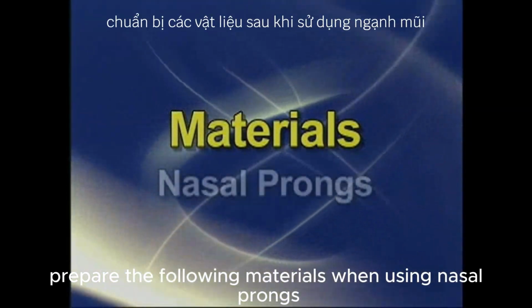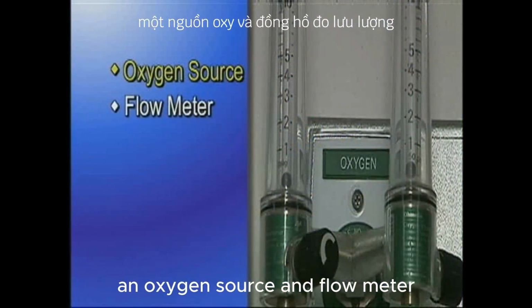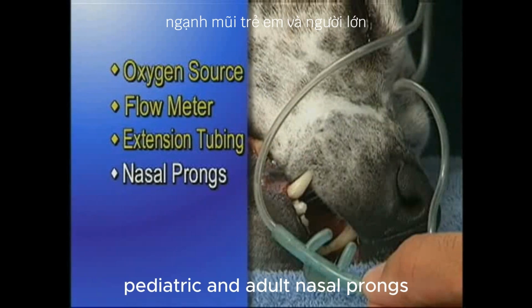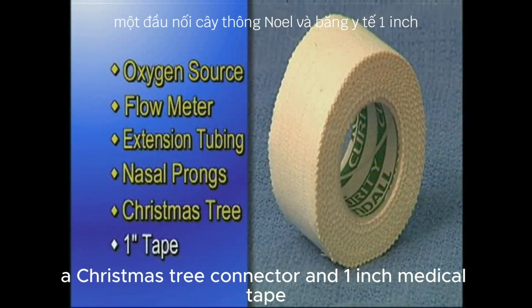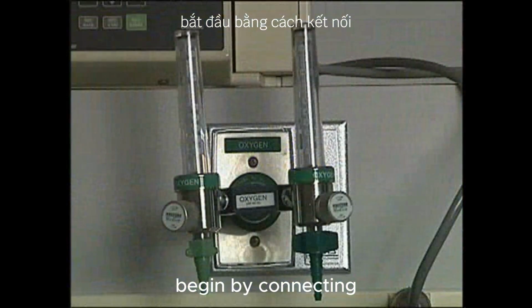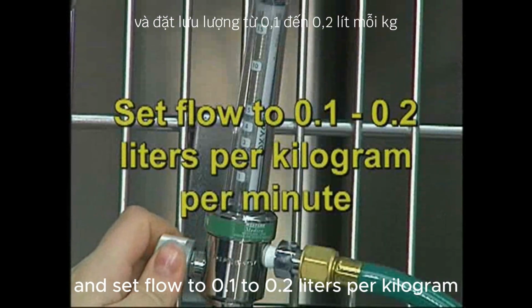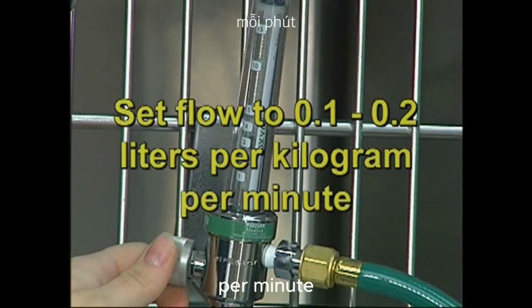Prepare the following materials when using nasal prongs: an oxygen source and flow meter, oxygen extension tubing, pediatric and adult nasal prongs, a Christmas tree connector, and 1-inch medical tape. Begin by connecting one end of the oxygen tubing to the flow meter and set flow to 0.1 to 0.2 liters per kilogram per minute.